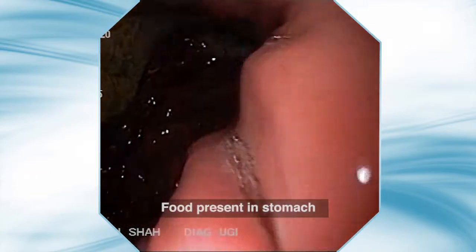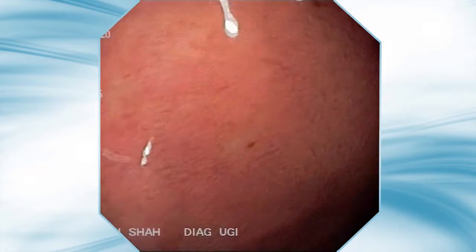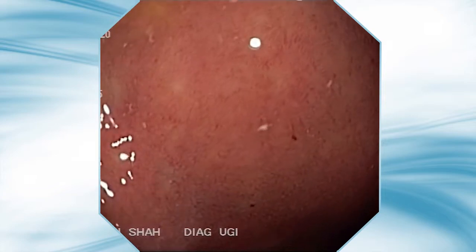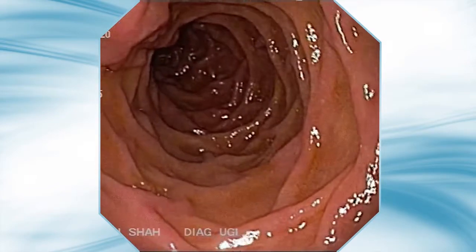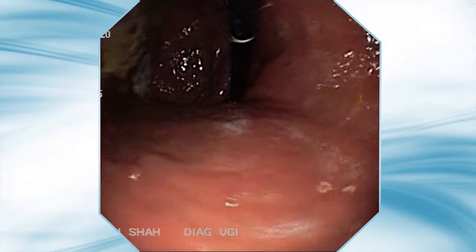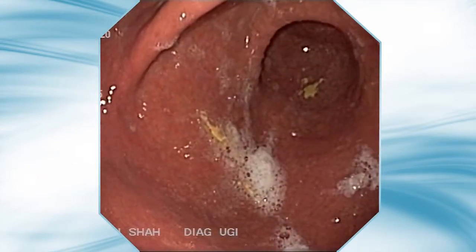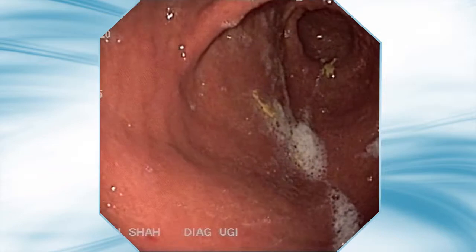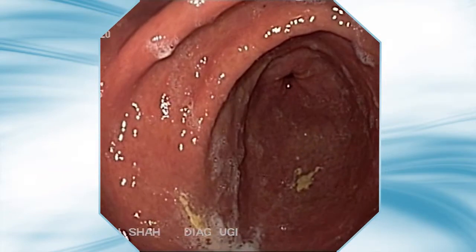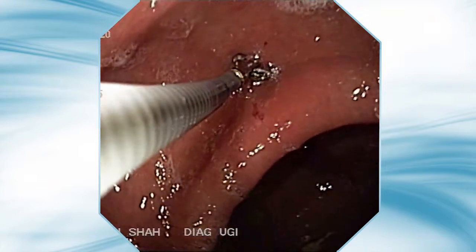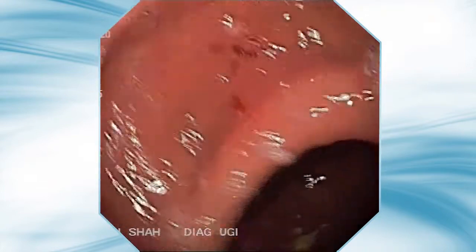The stomach contains undigested food particles. The papilla over the medial wall of the duodenum is visible. Hiatus hernia is also visible on retroflexed view. A biopsy is taken from the antrum for H. pylori testing.